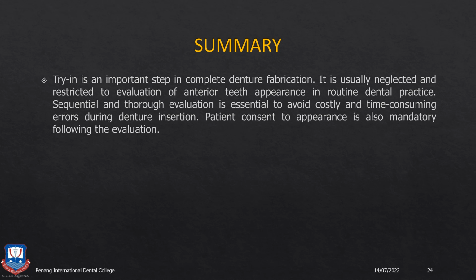So all these things can be avoided by a proper thorough checkup during the trying appointment, and adjusting and correcting those things at that time, instead of having to fabricate a new denture, or to reline or rebase the denture, or to again remove the teeth and do a new setup on the denture which you have just delivered.